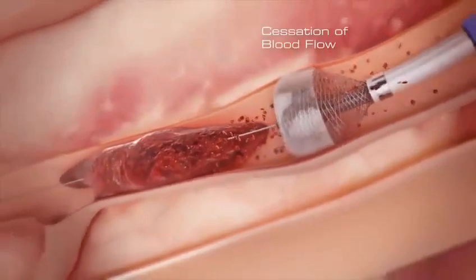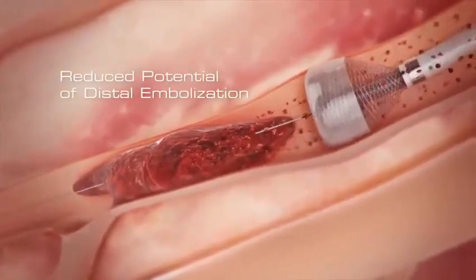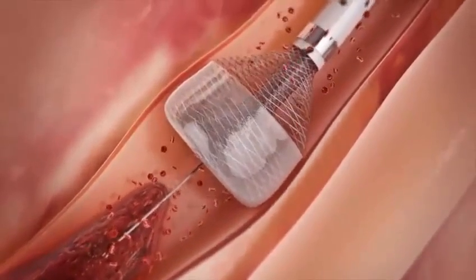Cessation of blood flow prevents clot fragments from traveling downstream, greatly reducing the potential for distal embolization. The patient's blood pressure, along with the radial force of the funnel tip, combine to press the device against the arterial wall.